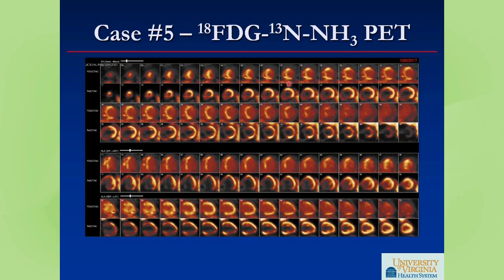And there is a corresponding FDG uptake in that area, and this is highly concerning for ongoing severe inflammation that's leading to scar deposition, versus, as I was saying, perhaps they had scar there before, had inflammation there before that had resolved and scarred, and now they have new inflammation in the area. But I would tend to think it's probably the former rather than the latter.